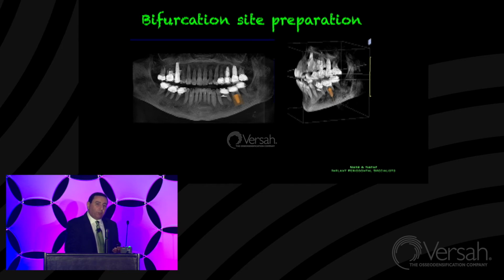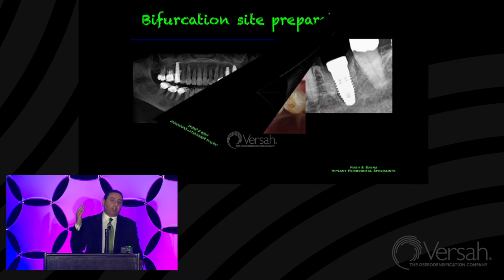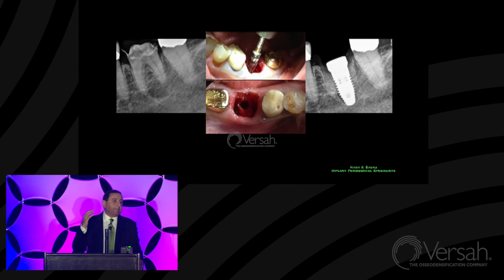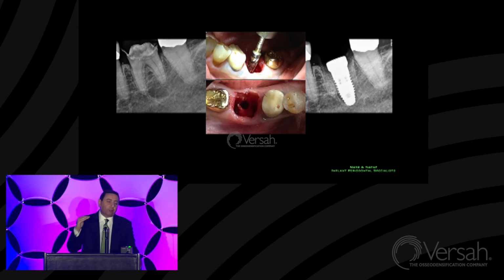Typically, I start with a precision drill if the interradicular furcation bone is very thin, and this goes for the trifurcation as well, because in the past, in maxillary immediate molar extractions, I would core out the trifurcation area, and if the bone core remains, I would push it and elevate the sinus floor along with the core. But it's difficult when the sinus floor is wavy, when it's not flat.